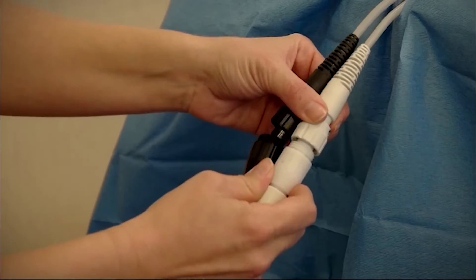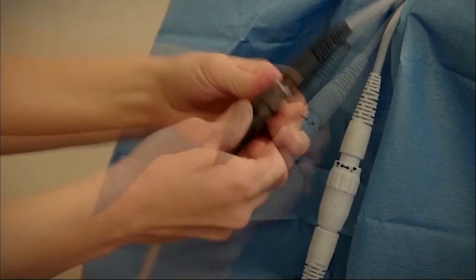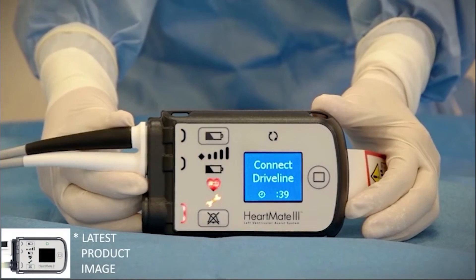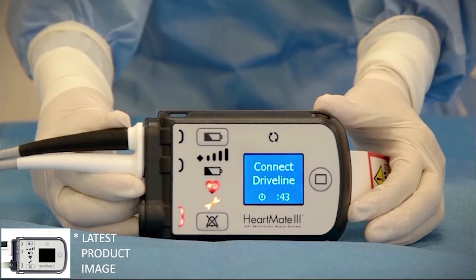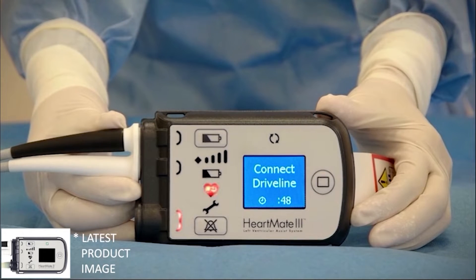Then connect them to the bifurcated ends of the power module patient cable, white to white and black to black. Both the power module and the system controller will then indicate a hazard alarm condition, signifying that the system controller is powered but not connected to the LVAD.